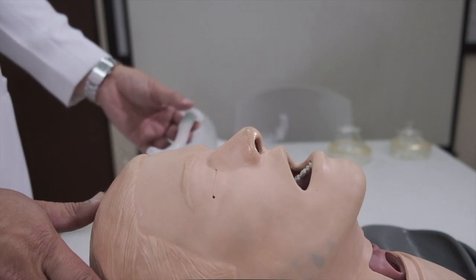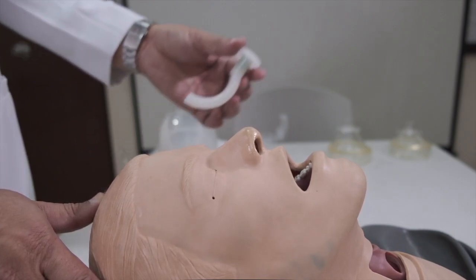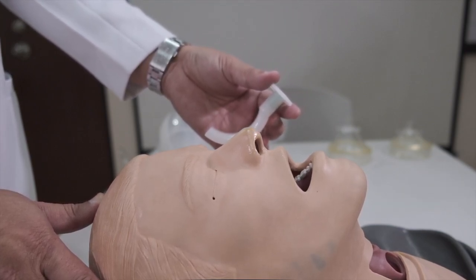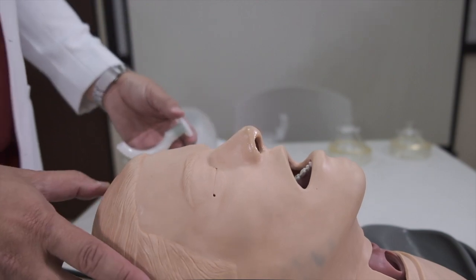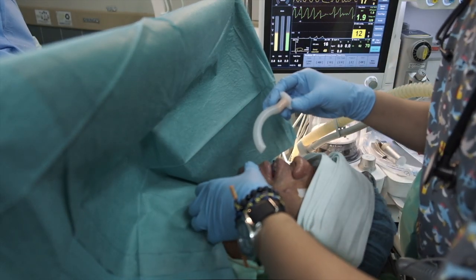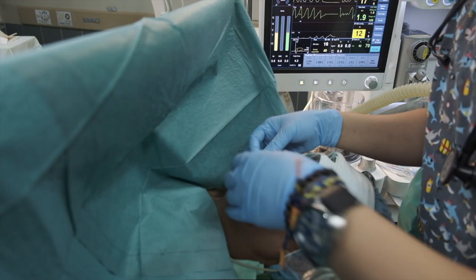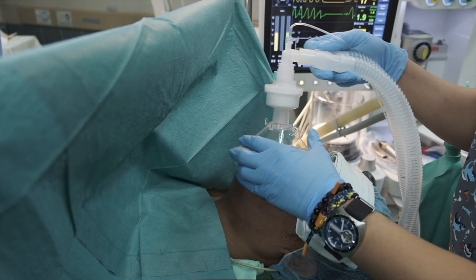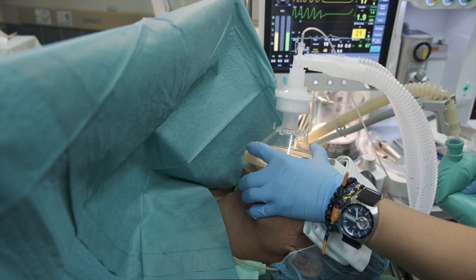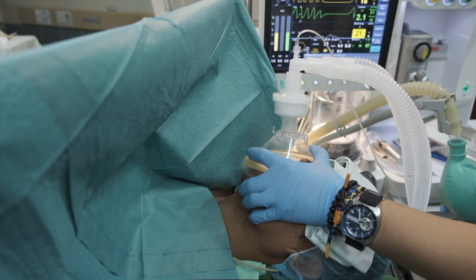So I'm going to demonstrate how to properly insert an oral airway, an oropharyngeal airway. So you need an appropriately sized oral airway. You start off with the tip, this tip, facing cephalad, going through here, and then twist. So the tip now faces caudad, and then insert.